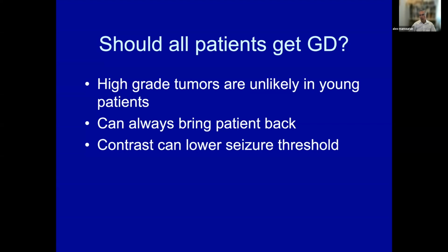And the second reason you don't want to give gadolinium is that iodine-based contrast and gadolinium-based contrast slightly decrease the seizure threshold. So if you have a patient who is prone to have seizures and you give them contrast, there's a chance, small, but there's a chance that you will incite or propagate a seizure of a patient inside your MR scanner, which is of course quite undesirable.